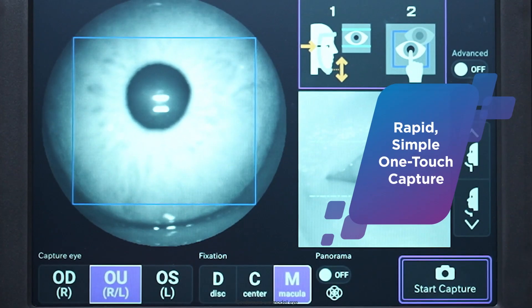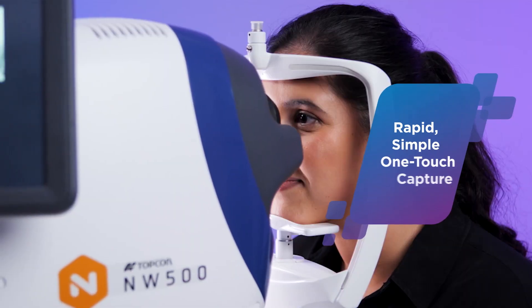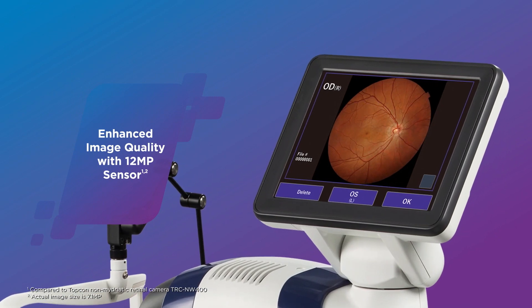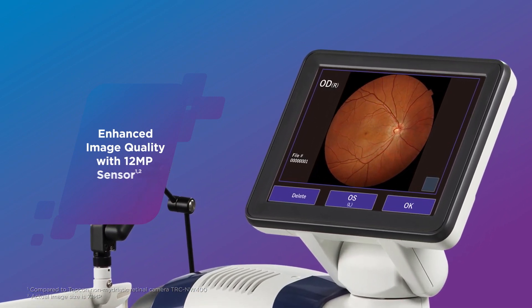Rapid and simple capture by single touch of the screen makes it easy to delegate to staff members. The new 12 megapixel image sensor delivers enhanced, sharp quality retinal images for clear review and analysis.